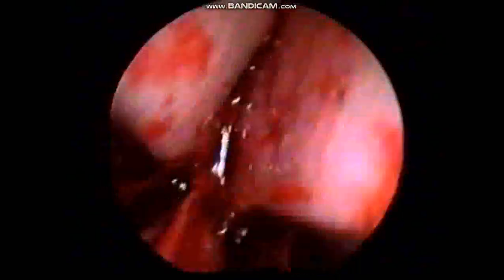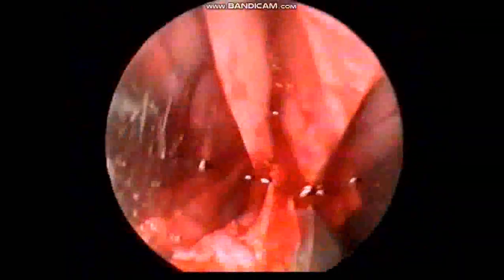The same procedure is done on the other side, which we usually call tunnel number 2 and tunnel number 3. Now the posterior part of the bony septum is also separated.